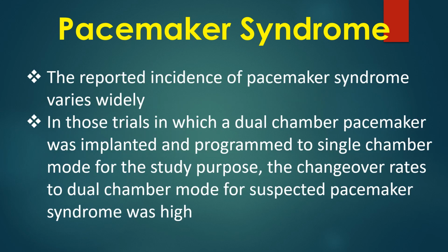The reported incidence of pacemaker syndrome varies widely. In those trials in which a dual chamber pacemaker was implanted and programmed to single chamber mode for the study purpose, the changeover rates to dual chamber mode for suspected pacemaker syndrome was high.